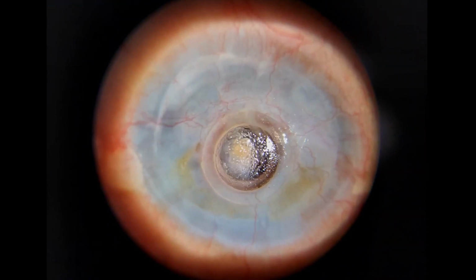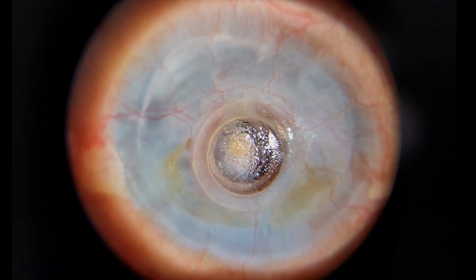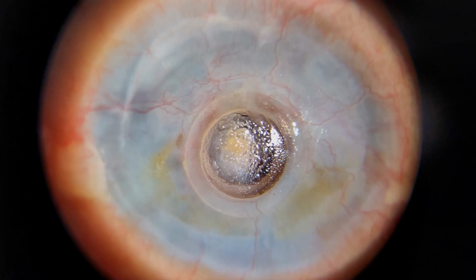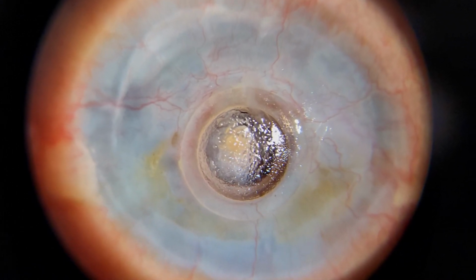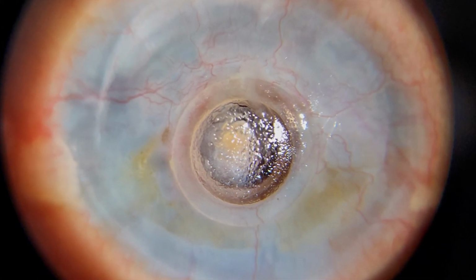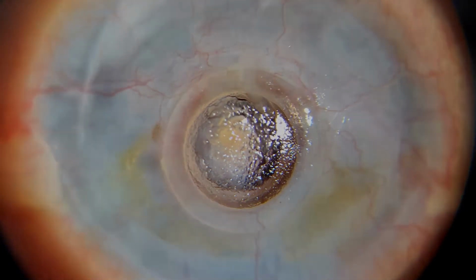However, the other eye had undergone a keratoprosthesis implantation a few years back, to be exact about 4 years back, which has finally resulted in the loss of vision in this eye. And we can see this keratoprosthesis was still in place and this eye was symptomless.